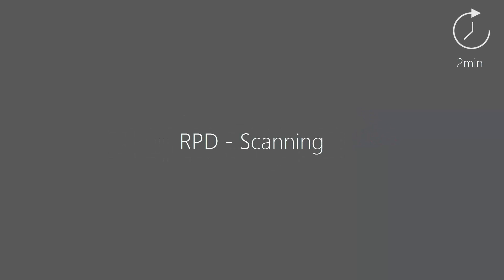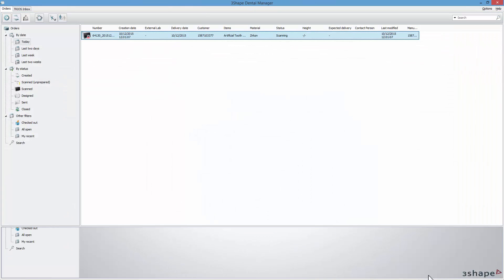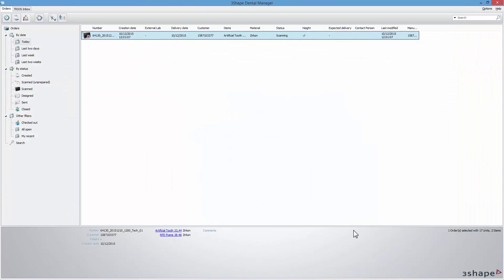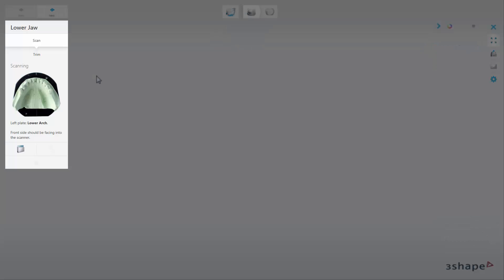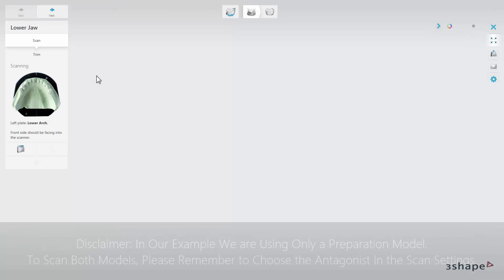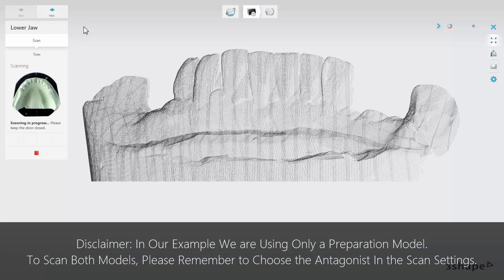In this video you will learn how to perform scanning for a removable partial denture. After you have clicked the Scan button, the ScanSuite software will open. The information box on the left will inform you what the steps are — please follow them carefully. In our case, we will scan only the lower model. Click Next to begin the scanning process.